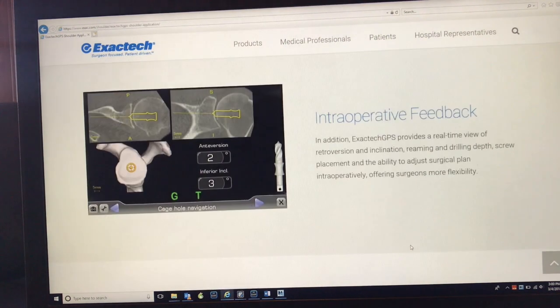So anyway, that's an update on what we're doing in shoulder arthroplasty. Again, I think this is extremely exciting. I personally think Exactech has the best components. The glenoid component, which is the key to total shoulders, is in my opinion the best out there. I personally have ones that are 5 years out that look like they're 1 day old, and patients do great with this prosthesis.